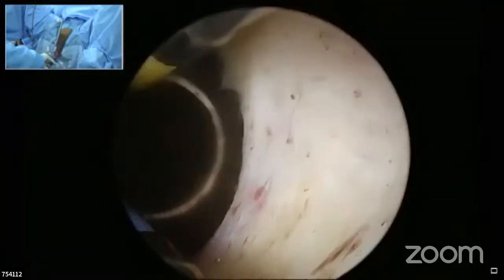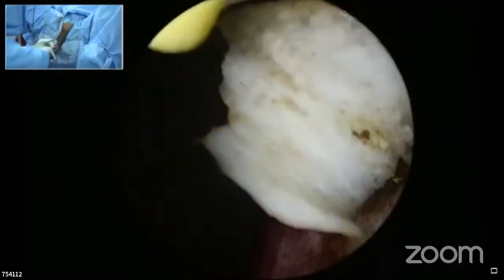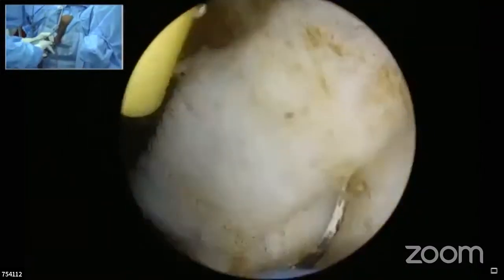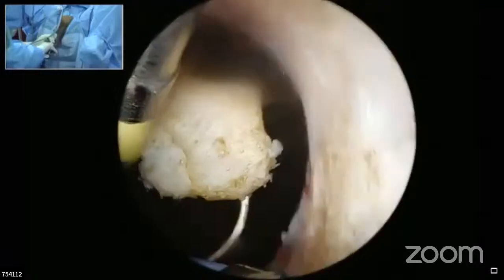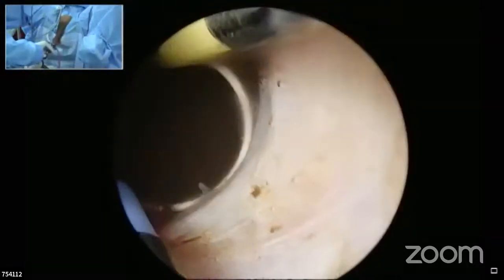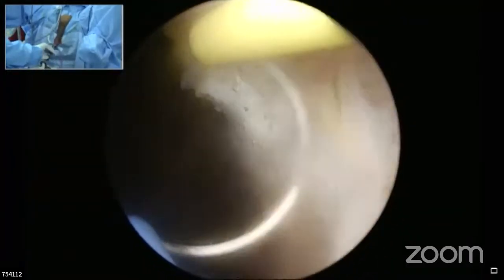Whereas if there is a capsular vessel or a vein which is open, your ability to resect will come down and the vision becomes much more difficult. If you can't finish the procedure in the next 15 minutes, I think it is better to stop, keep a catheter, give some traction and go back again after a day or two.